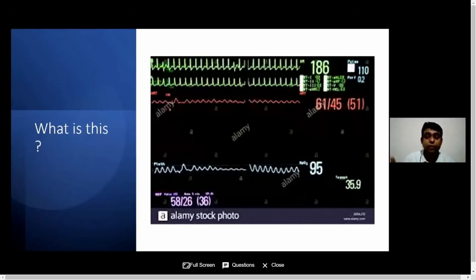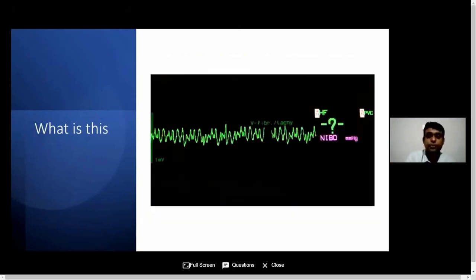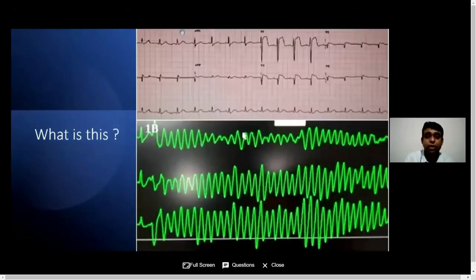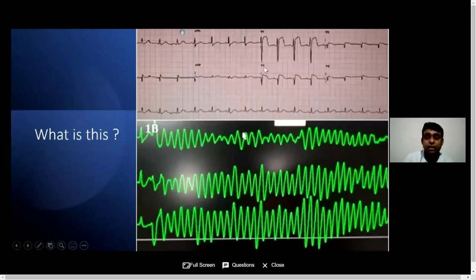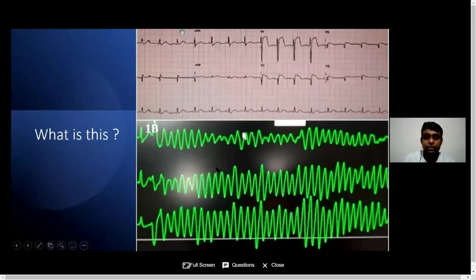Remember the self-adhesive defibrillation patches — this is where you need to bring your defibrillation machine close to the patient and alarm your doctor. This is ventricular fibrillation. If you see this, you need to jump to the patient and start CPR. Look at this patient — the ECG shows the patient has developed ST elevation, and now the patient has gone to ventricular fibrillation. These are life-threatening situations. You need to pick these things up and start CPR.